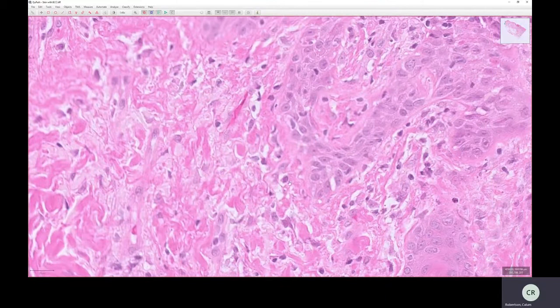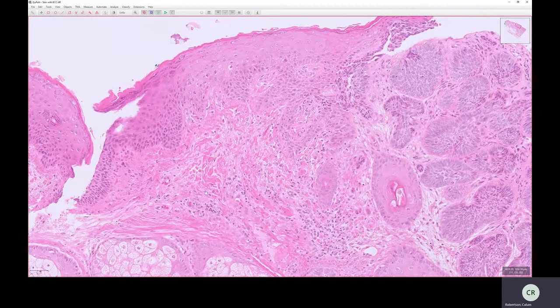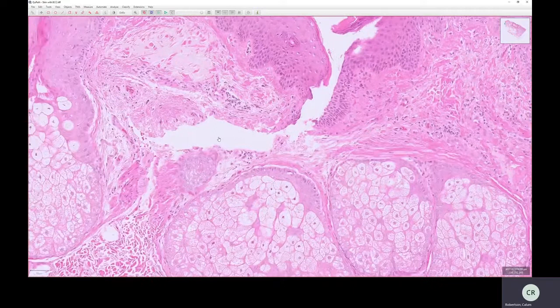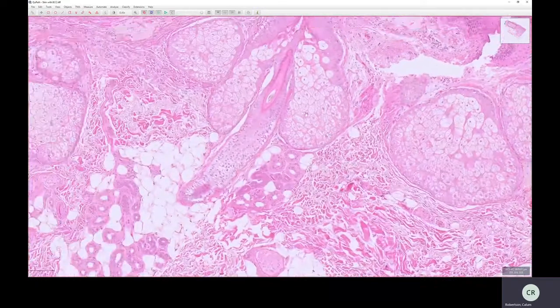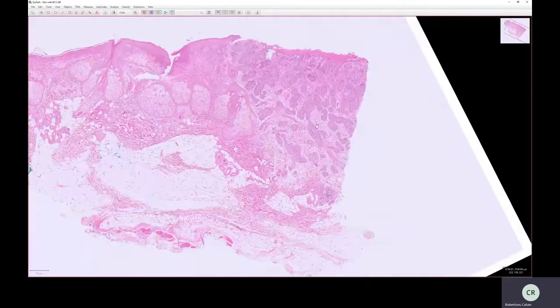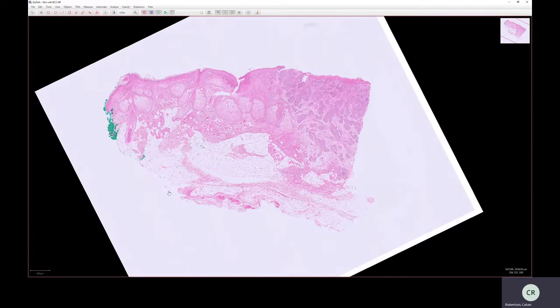So all the pink stuff is being stained by eosin, and that stains largely the material that's not within the nucleus. So it'll stain the cell cytoplasm and the extracellular material pink, and various shades of pink. And that is all that we see here. Well, all the varied appearances of all the cell types and tissue types are all a result of just these two simple stains, which have been around for over a century. And through the combination of these stains, we can diagnose the vast majority of the conditions and the vast majority of situations. All that is required for diagnosis is an H&E stained slide.